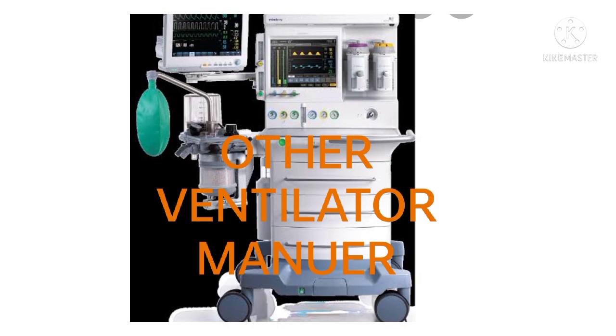In patients with short exhalation times and early airway closure, for example asthma, setting PEEP above auto PEEP can offset auto PEEP effects by splinting the airway open during exhalation and preventing air trapping. In general, the main purpose of PEEP is to maintain or improve oxygenation while limiting risk of oxygen toxicity. FiO2 can often be reduced when PEEP is used. PEEP is generally indicated in all patients who are mechanically ventilated.